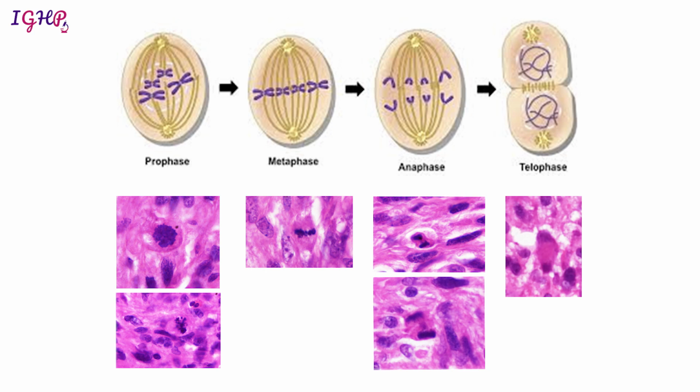So these are all prophase. Now any mitosis that you will see on your slide will be hyperchromatic as opposed to these cells which are seen in the background. So these kind of mitosis are normal mitosis, they just mean that the cell is dividing. Then we have the metaphase where all these chromosomes are aligned in the center, and most often in all your malignant lesions you will see a large number of mitosis in the metaphase where the nuclei are aligned in the center. So this is very common.